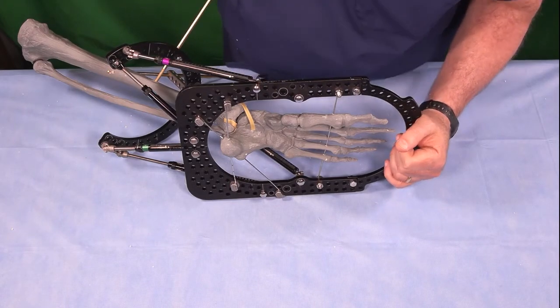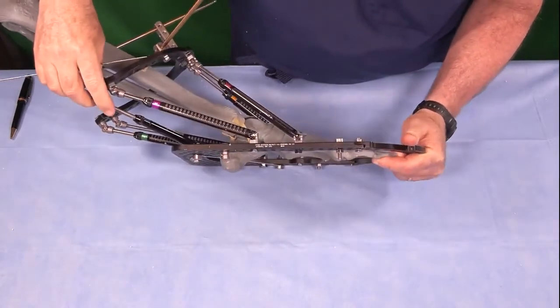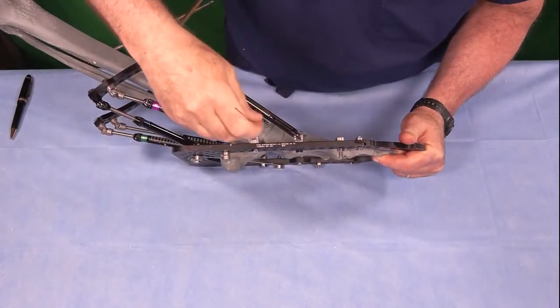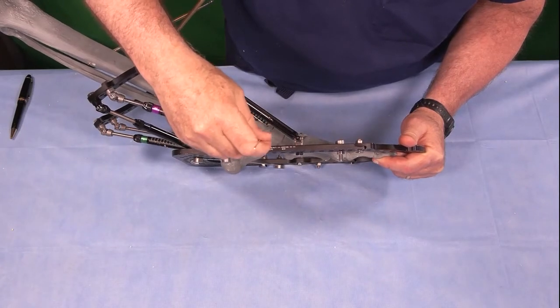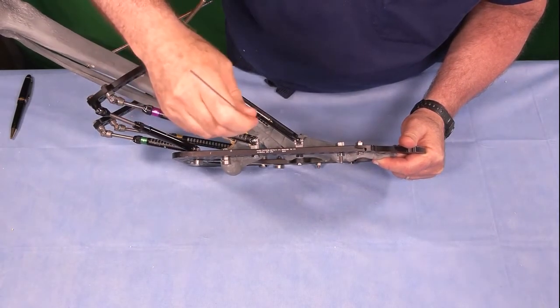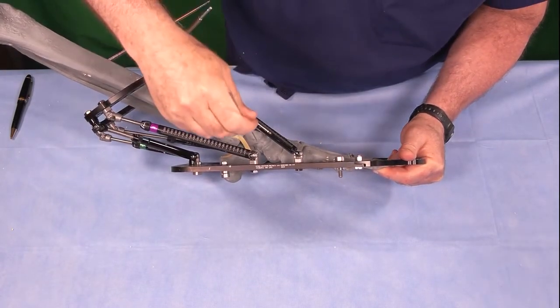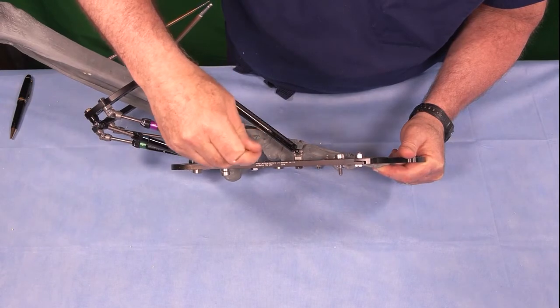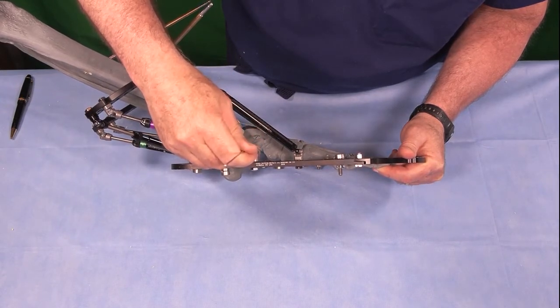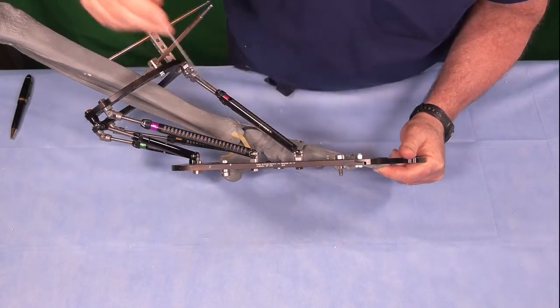Why did I do that? I want to pass another wire on the neck of the talus. And that wire on the neck of the talus is difficult to get past a strut if the strut is in the normal configuration through this hole. So this is just a little small trick that makes it a little bit easier for configuring wires in the neck of the talus for foot frames.